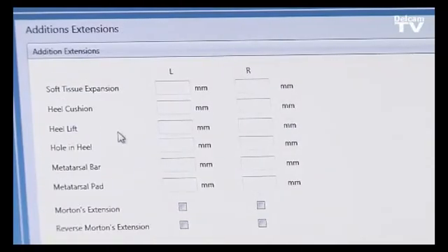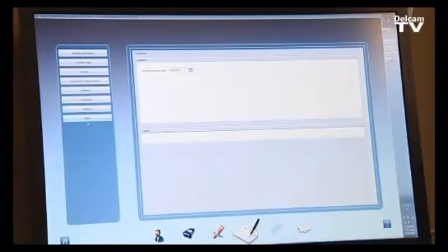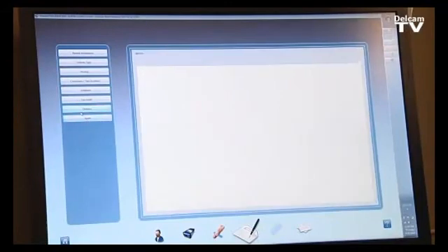Additions such as a heel cushion or a heel spur hole can be specified. We also select the top cover — whether a full top cover or three-quarters — along with the material and its thickness. Finally, we set the delivery date for when the orthotic should be delivered, along with any important notes.